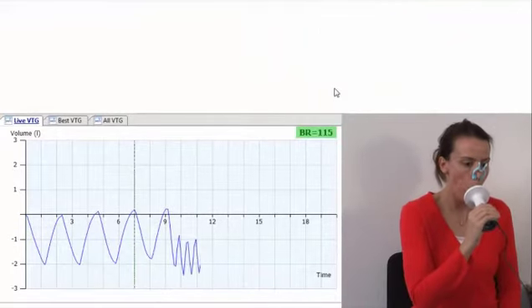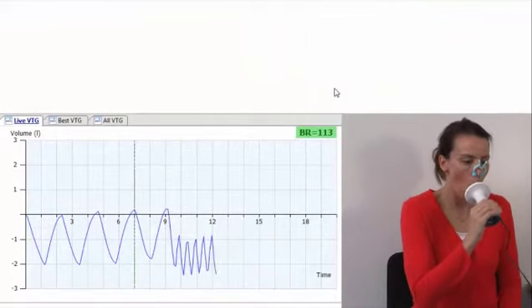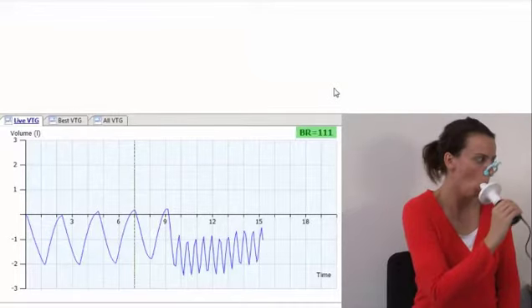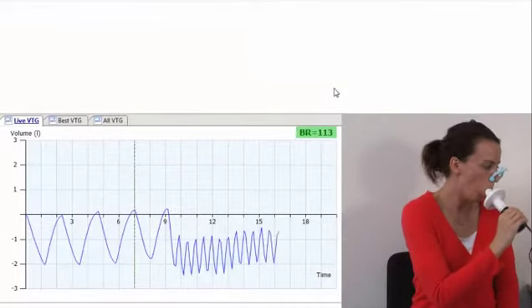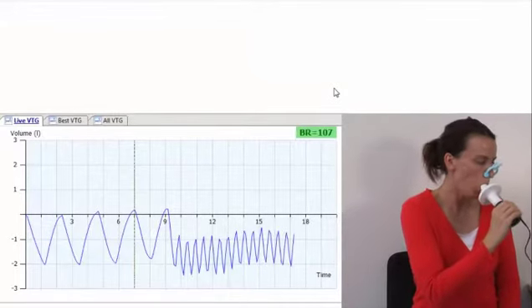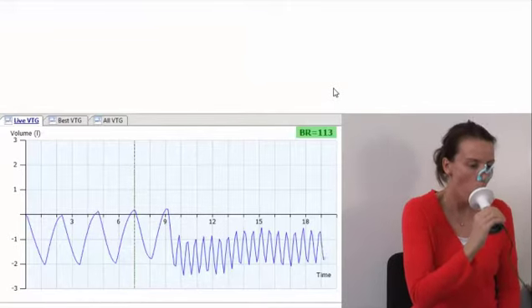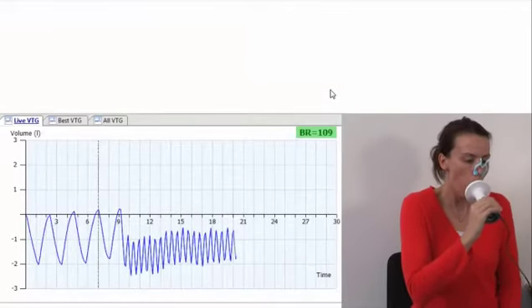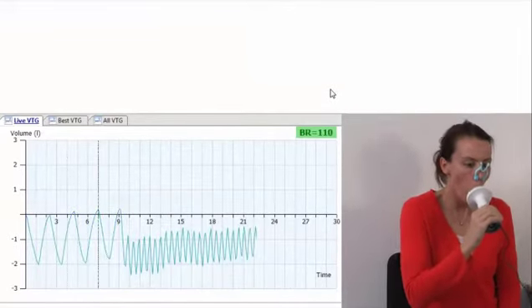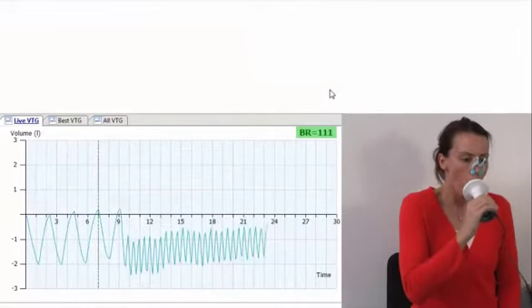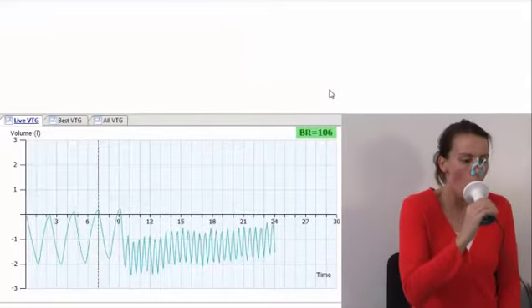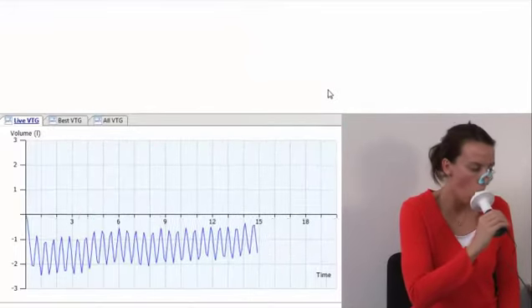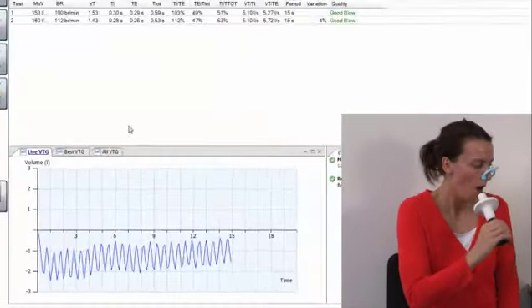Now. Good. Keep going. Keep going. You've got five seconds. Five more. Good. Keep going. Okay. And stop. Good. You can stop. Perfect.